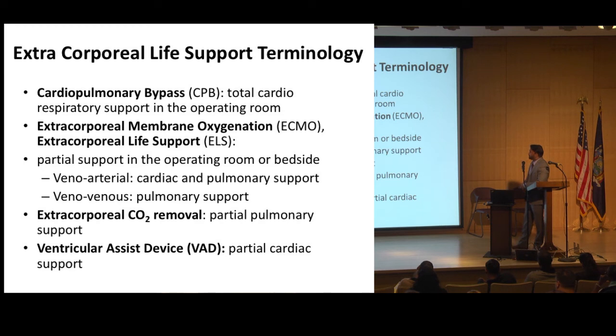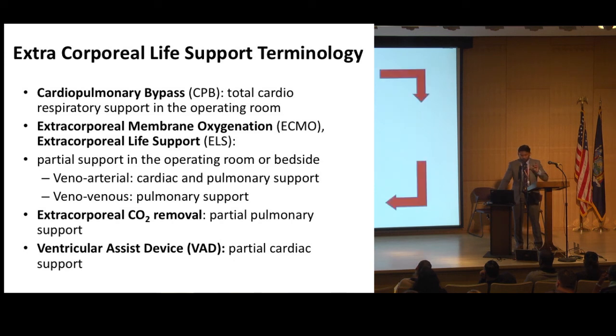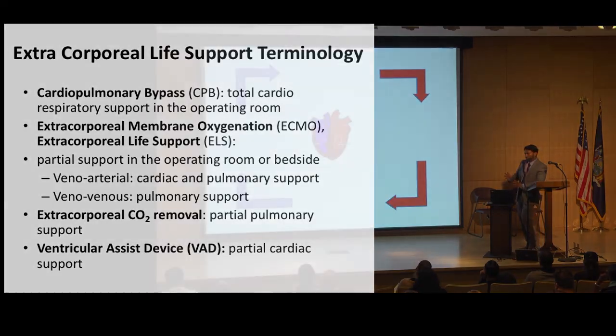A few of the terminologies you might see, whether in your institution, in books, or in the literature, are cardiopulmonary bypass, ECMO, ELS, LVAD, and all that stuff. The whole concept here is how you can support the body until it rests and heals, and take the stress away. And in the meantime, how is the deoxygenated blood being fixed? We'll talk about that as well.